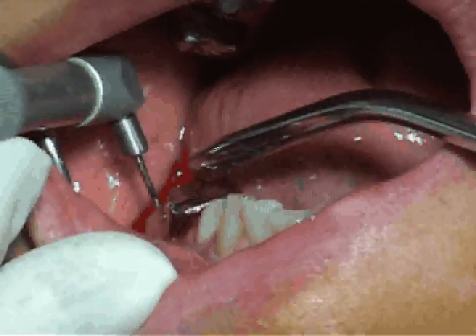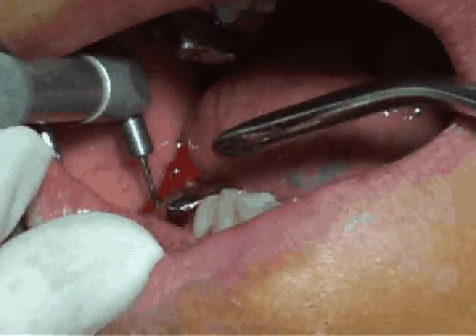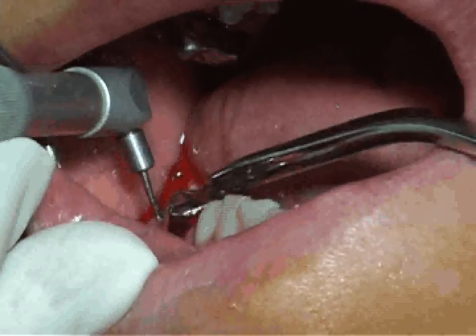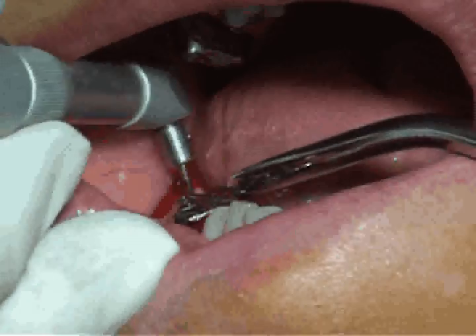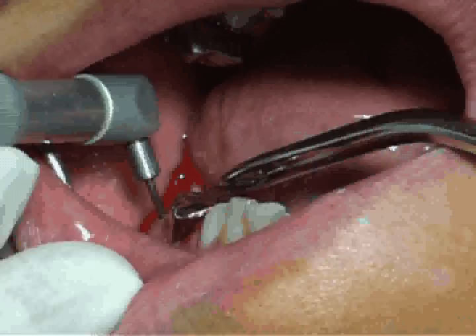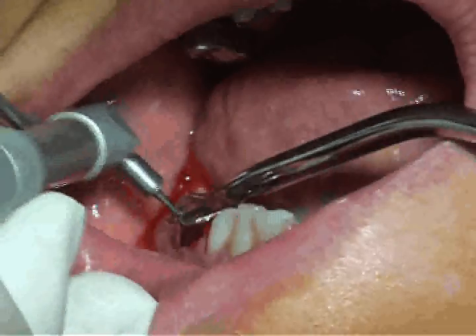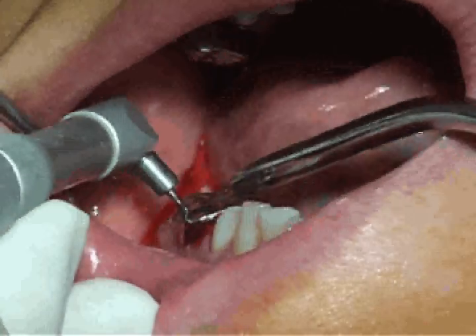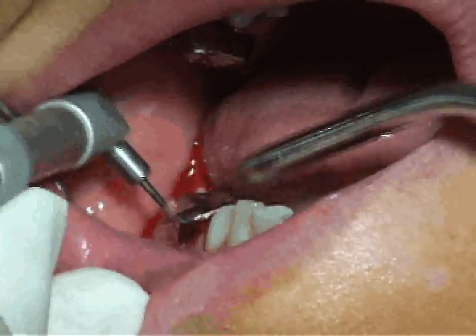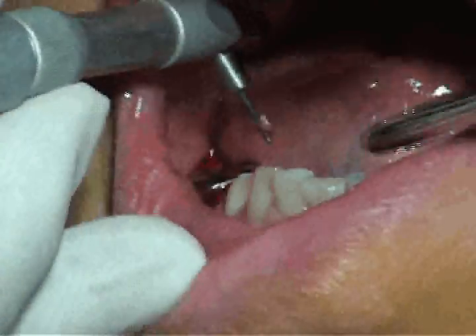What we're doing is taking the CO2 laser and doing a gingival curettage. We just gently sweep it around the tooth, and it basically takes off the lining of the gingival sulcus. And where there's granulation tissue, it just kind of bubbles. You can see the granulation tissue coming up on the perio tip.